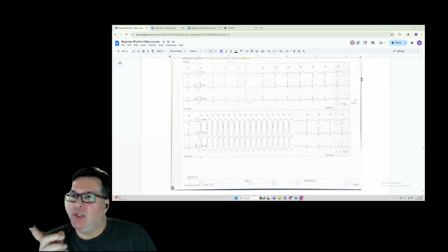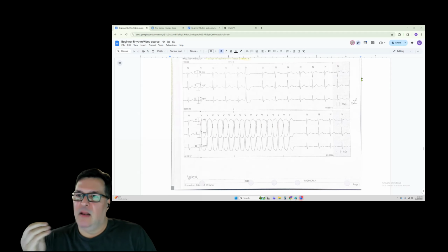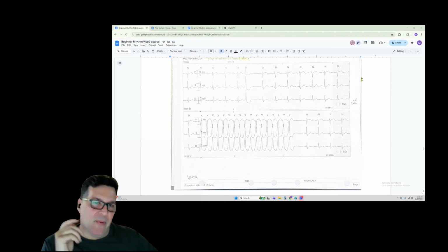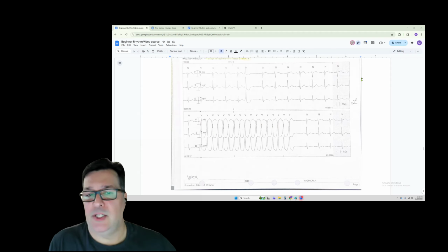That's interesting. So do you think there is a delay? Like if I let that alarm ring for 5 seconds, it will get to your phone? Or if I immediately silence it, it doesn't get to your phone? I don't know if it works like it does at Main General because I just don't have that. I haven't worked in tele, and I feel like I would need to be in the tele room with my phone. I mean, you could stand next to your monitor in the unit. Yeah, that's not trustworthy. Okay, anyways, so communicate, whatever your escalation is.